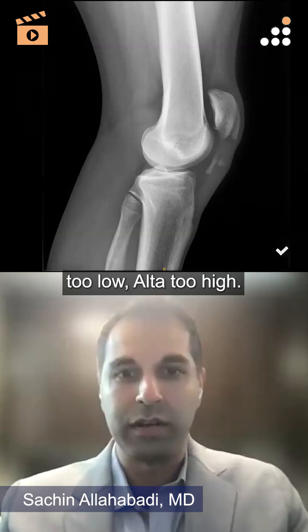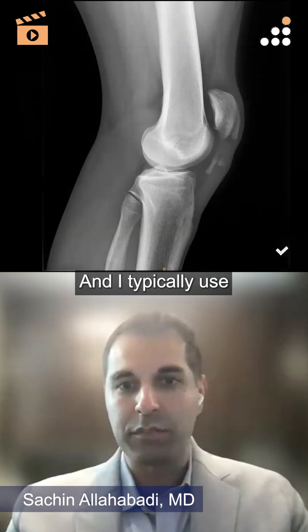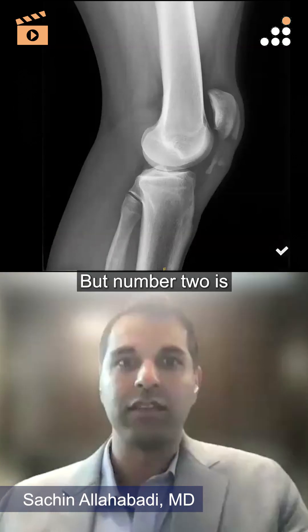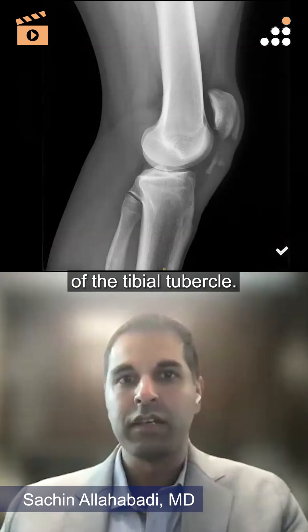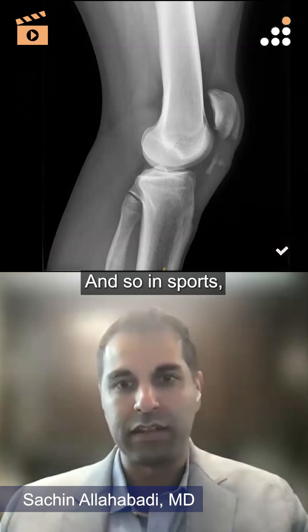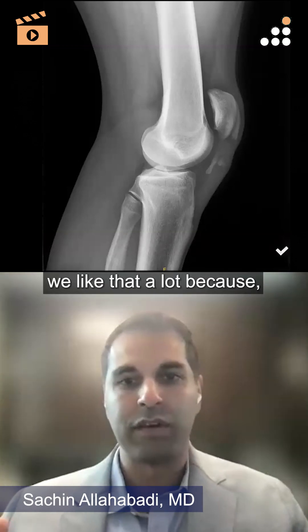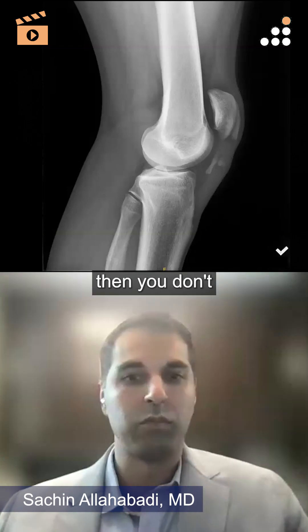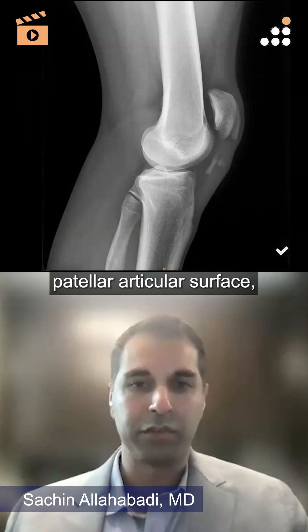I typically use Caton-Deschamps — number one because it's my favorite one to say, but number two is it doesn't depend on the position of the tibial tubercle. In sports medicine we like that a lot, because if people have had prior tibial tubercle surgery or fractures, anything like that, then you don't have to worry about that.